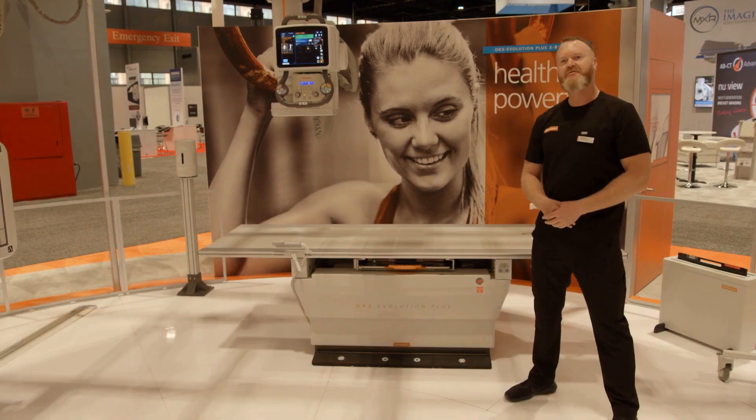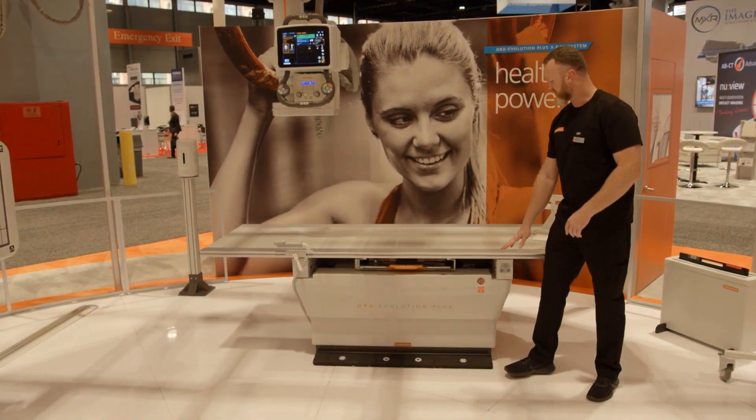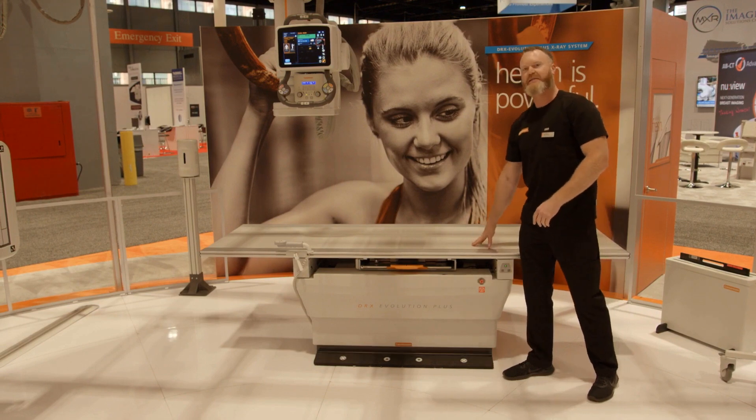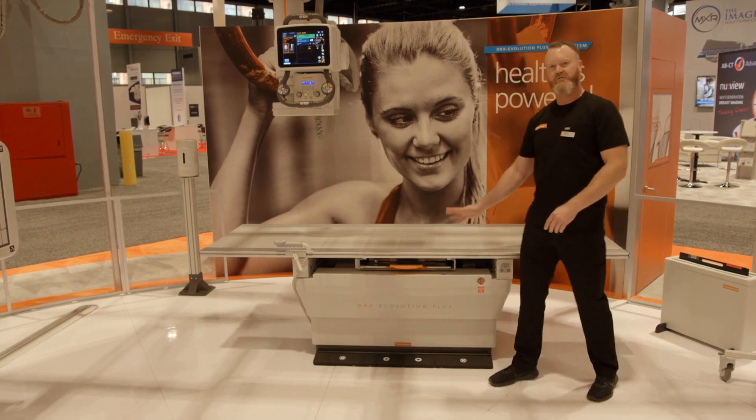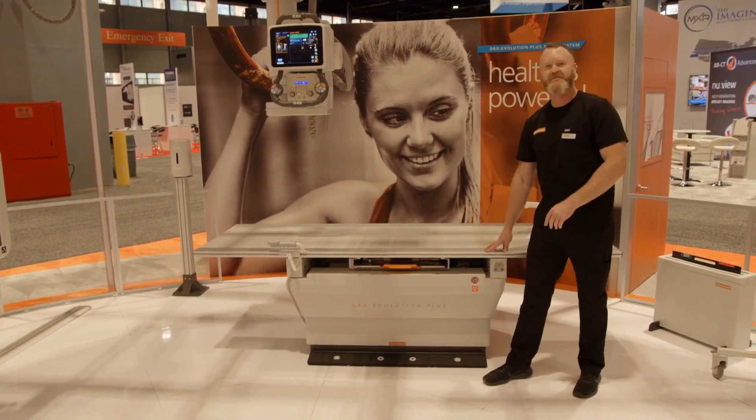We have a couple of new features this year. We have a flat table top. This is going to help with aiding patient transfers. There's no longer a ridge or hump to get over — you can just directly slide your patient onto the flat table top.